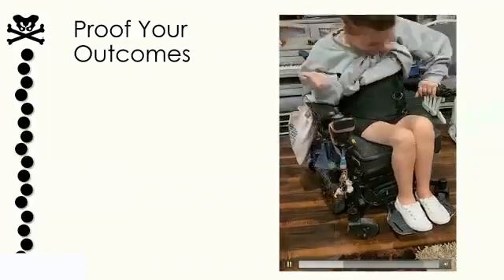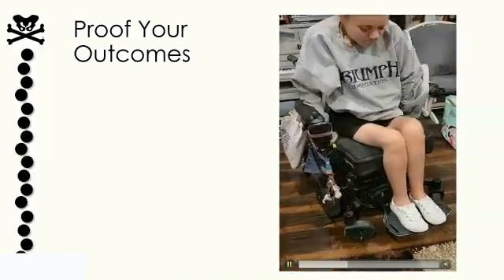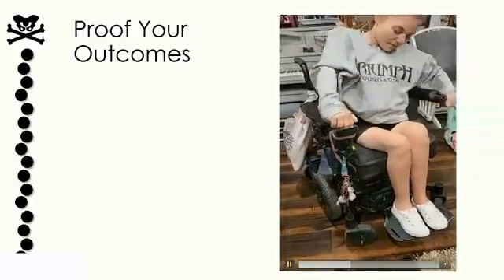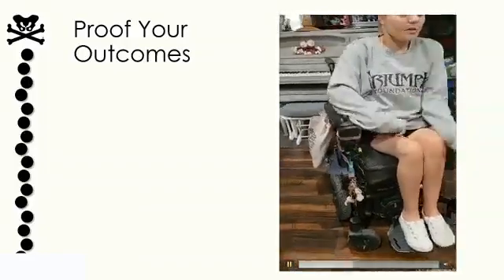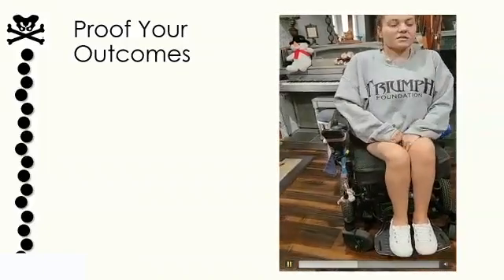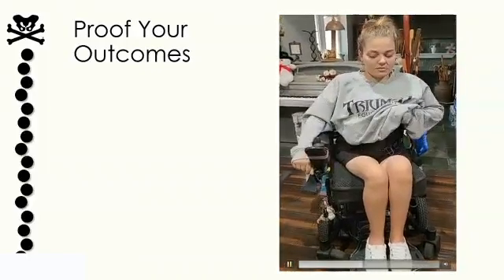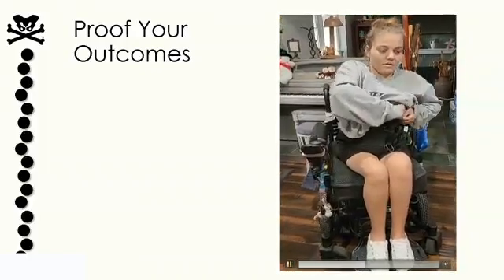She's going to reposition, and then she's going to say, yeah, that's it. That's my comfortable spot. And the smile comes, and they say, whew, right there. That's what I want. And there's her yes. And then she's going to go right into fine motor and then into gross motor.